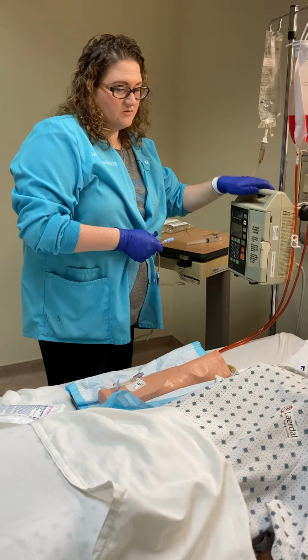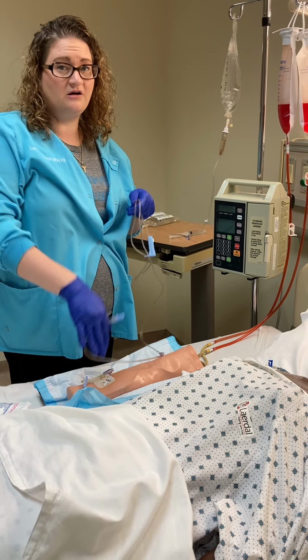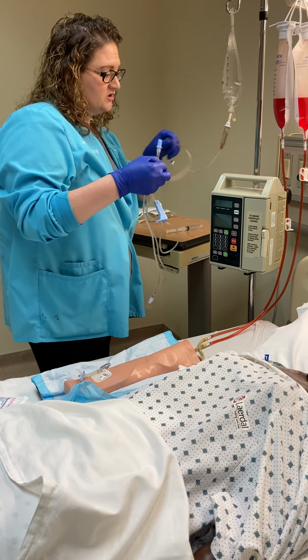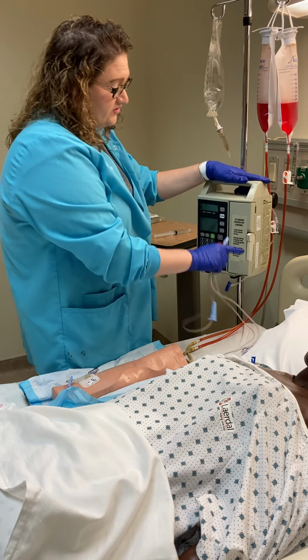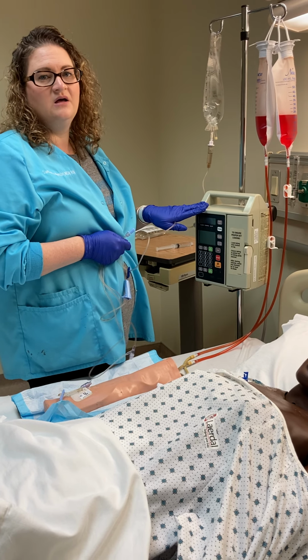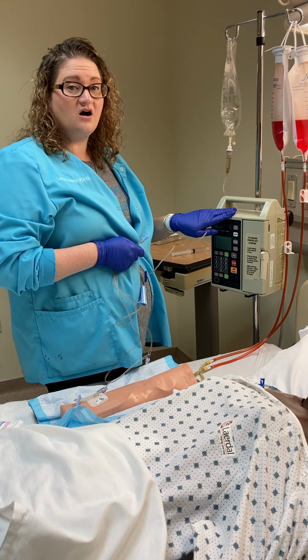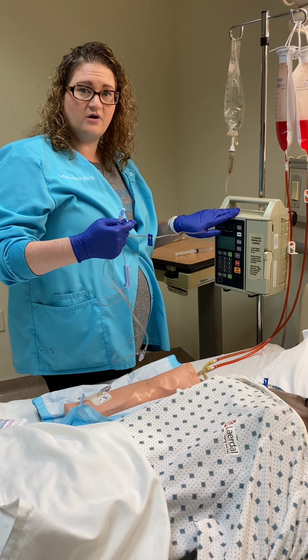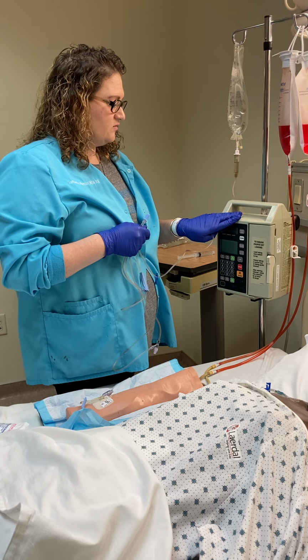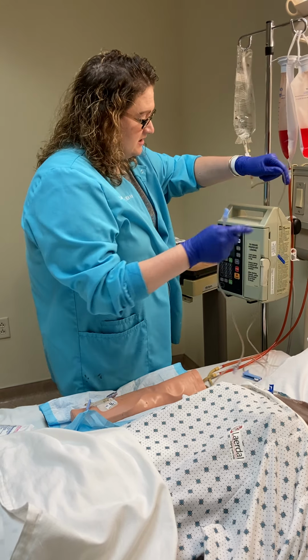Next thing I'm going to do is go to my pump, weave it through my pump and set my pump. Then I'll hook it up to my patient. Okay, so for this, these are the Baxters. They're a very basic pump. In the area, we don't see them too often. They are still out there in use throughout the country. And with all the pandemic stuff, it's a possibility that maybe you'll see it.